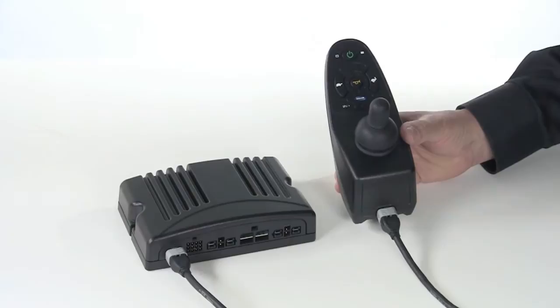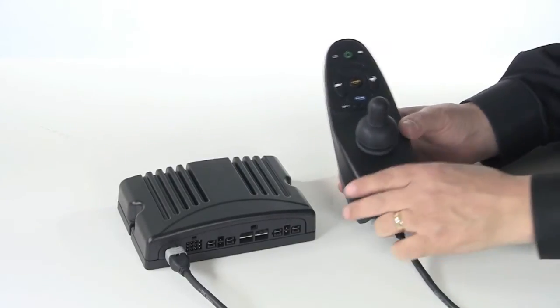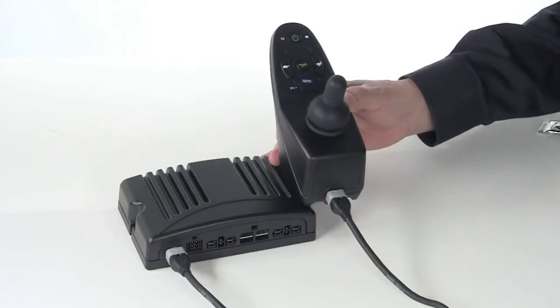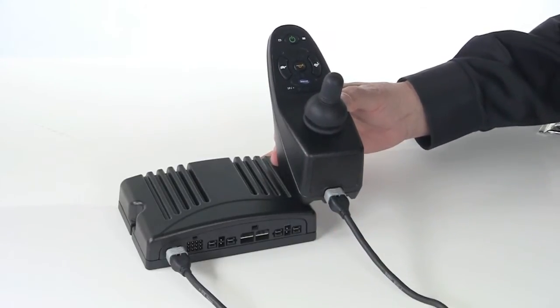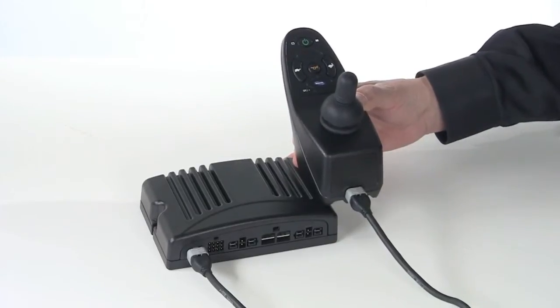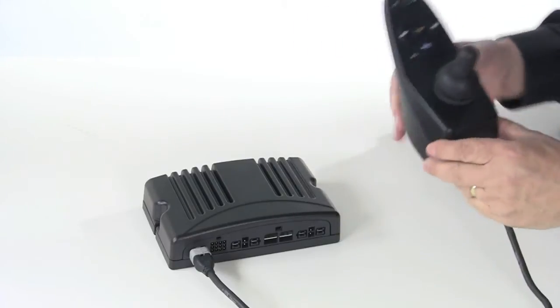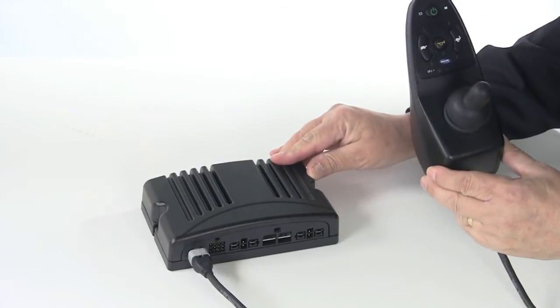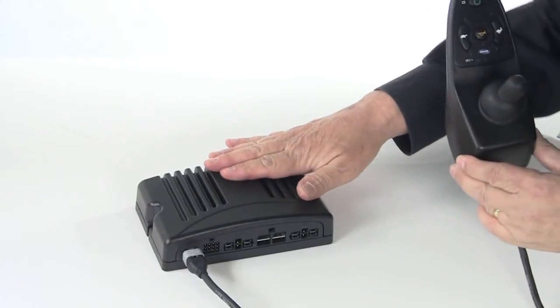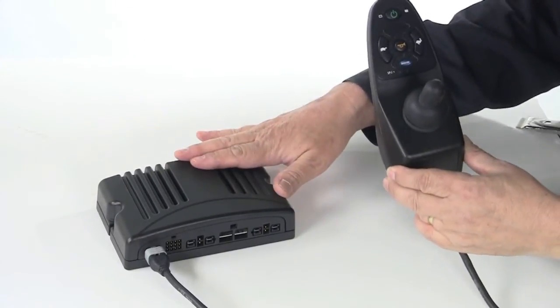Controllers and joysticks together are generally referred to as one of two types of systems: integrated or remote. An integrated system is one where the joystick and the controller are housed together in the same unit or the same box. Today, Invacare does not offer any integrated systems on any of its power chairs. A remote system is one where the controller and the joystick are separate units, with the controller generally mounted under the wheelchair. All of Invacare's power wheelchairs use remote systems.